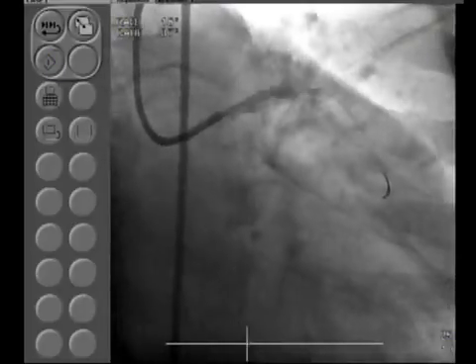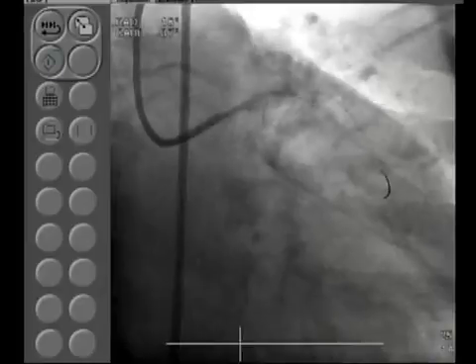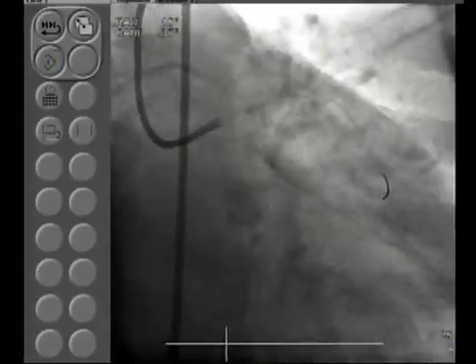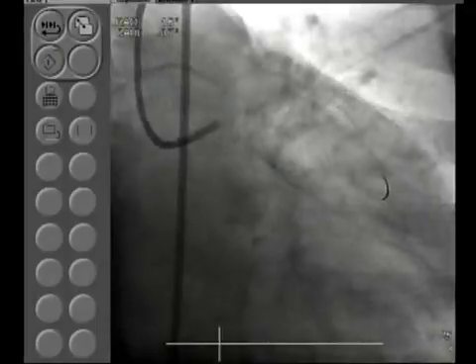In this bifurcation case, my strategy, knowing that there is disease only in the distal segment and so not a large vessel, is this: this is the ideal case for a stent crossover, a single stent from the proximal circ going into that large OM. With that note, what stent size and type would you use there?